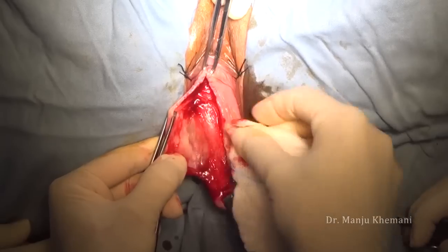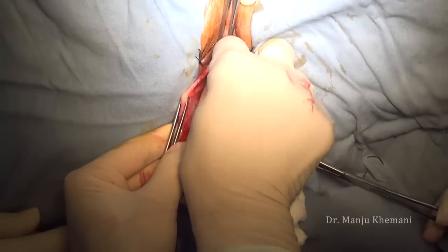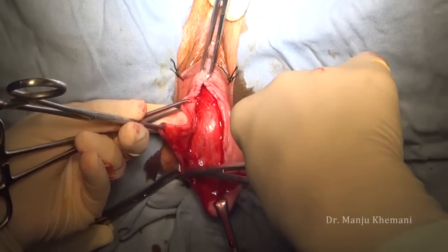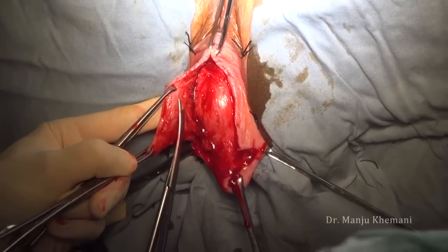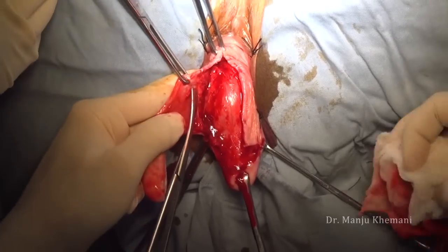Once you are in the correct plane, pick up the scissors and separate the vesicovaginal fascia rather than using a gauze piece and doing it bluntly. The first place to push the bladder down is in the center, because there you will find the correct plane. The bladder is very badly adherent at the top near the urethra and near the cervix. Here again I am trying to dissect the vesicovaginal fascia and separate the fascia from the vaginal wall.